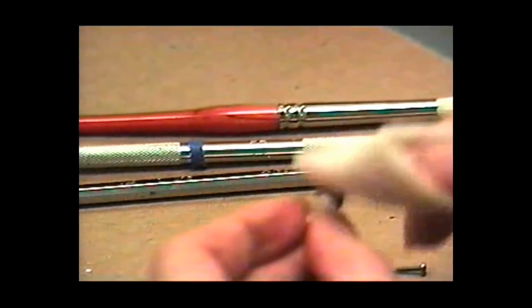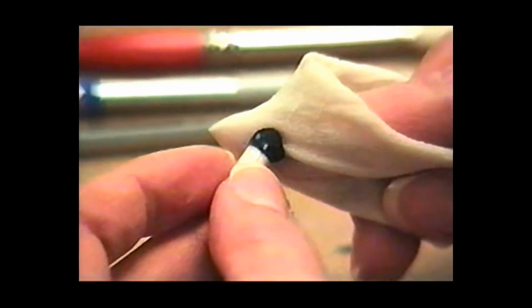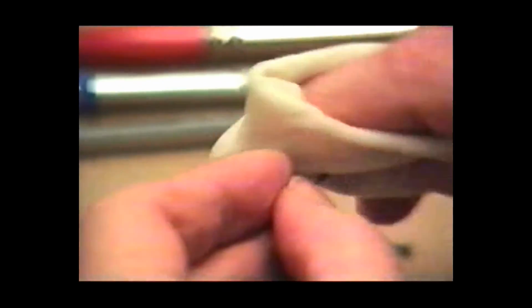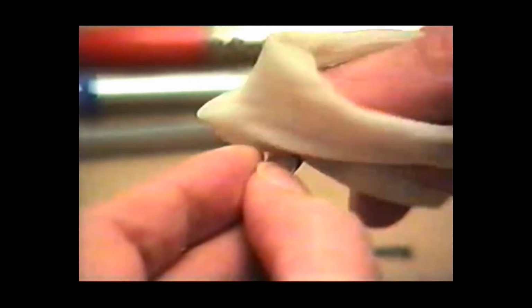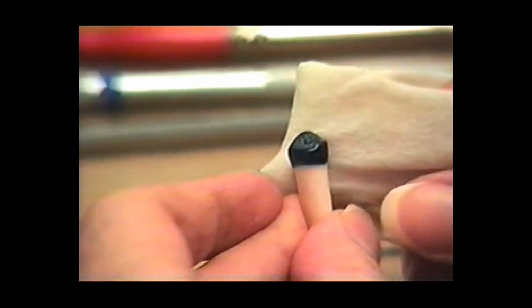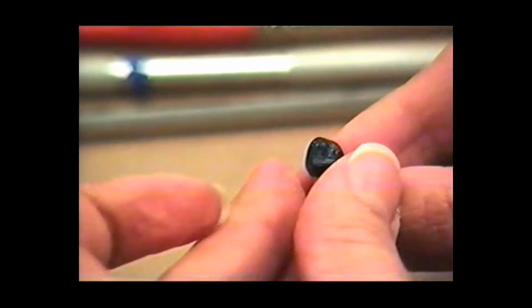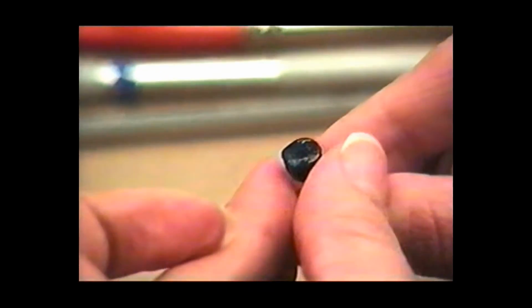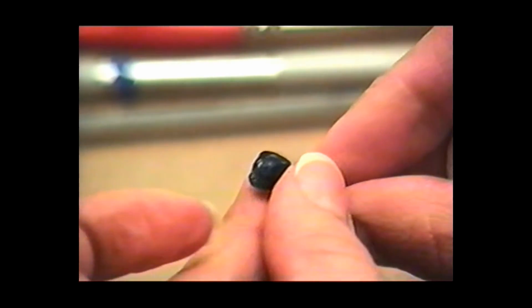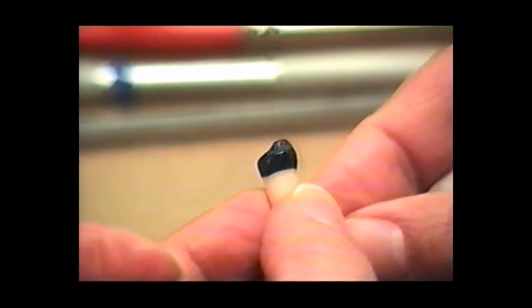This is just the final little bit of finishing. If you work on it for a long time, you can change the facial contours of your waxing. So go ahead and just very lightly, watching your proximal contact areas, and you can see I'm not doing a lot here, and it's already very nice and shiny. You can even do a little bit at the occlusal part of your waxing. And now what we've got is a very nice waxing that's pretty smooth. The finish is good on it, and it has its proximal contacts.